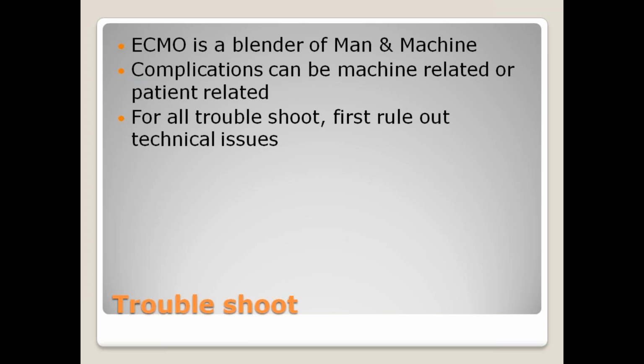So that is the reason, because technical issues will never give you time. Whenever something goes wrong with the patient on ECMO, always think first about the technical issues. Once you find all the technical issues are okay, then you think about something related to the patient. Because patient-related problems may not be that life-threatening, and that will give you some time to diagnose and then treat.